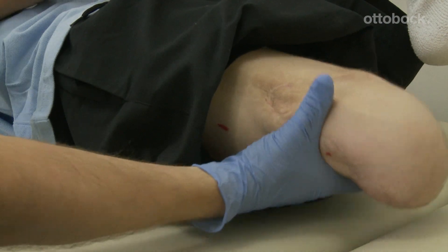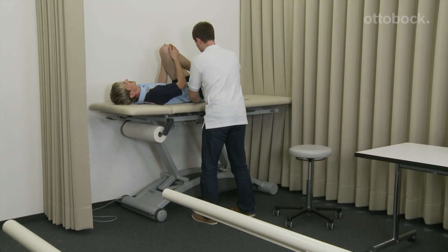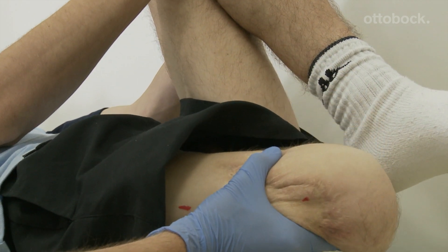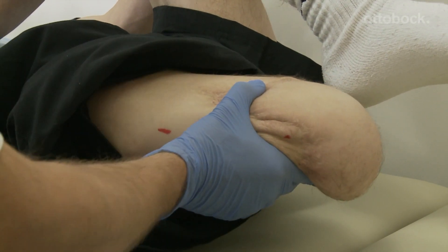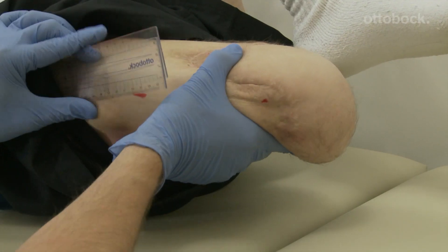The technician then places his hand palm down under the user's pelvis. With his other hand, he moves the residual limb carefully into extension. When the pelvis begins to rise, the hip flexion angle of the residual limb is measured in this position.